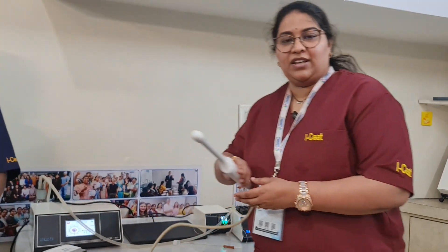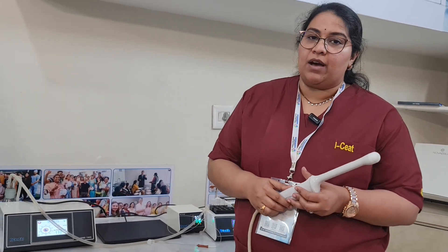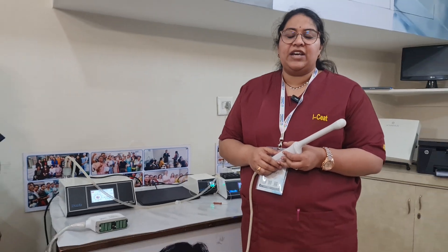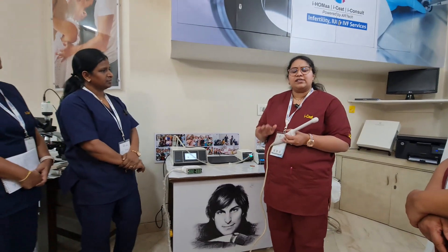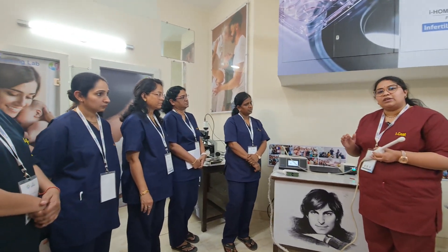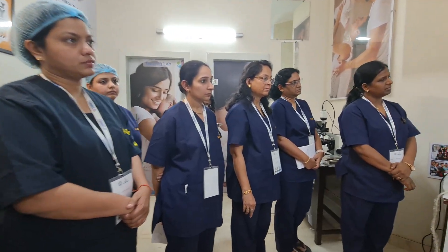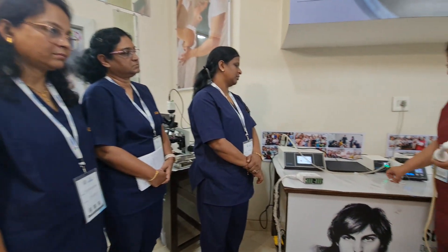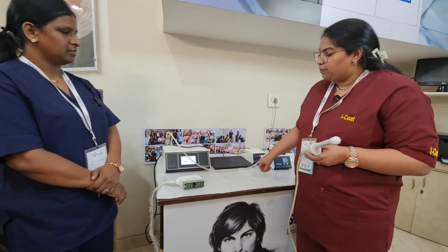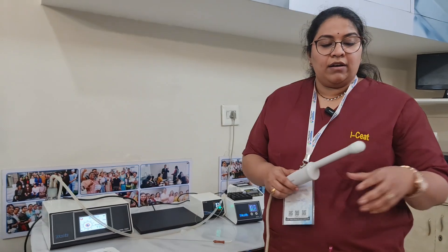I'm Dr. Jasti Pratyusha, travelling from Vijayawada, Andhra Pradesh. I'm going to explain the procedure for ovum pickup. Always ensure the patient has an empty bladder — ask her to empty her bladder 15 minutes before the procedure. The patient will be in the lithotomy position under general anesthesia or MAC anesthesia. The timing of the pickup is usually planned from 32 to 36 hours.